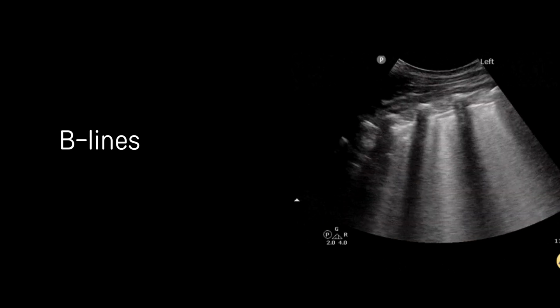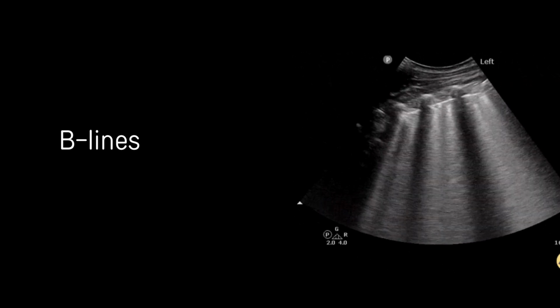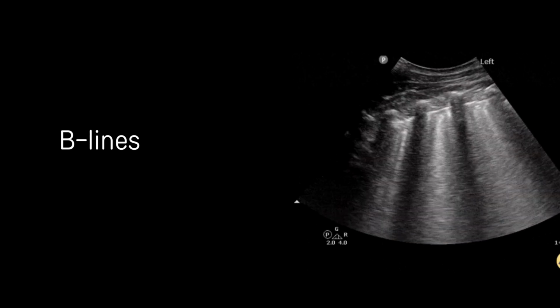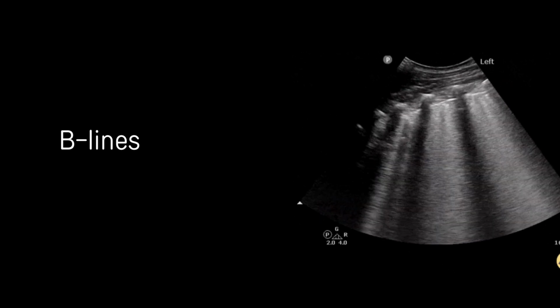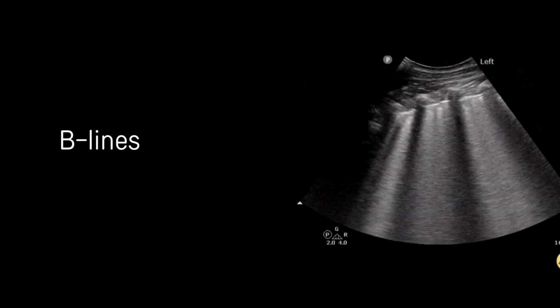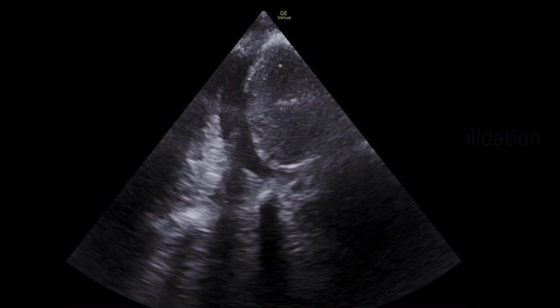There's something called the BLUE protocol. I don't want to go into the BLUE protocol. That helps you from a lung ultrasound point of view, figure out what's wrong with your patient. Why is your patient short of breath? It's on that POC app. POC 101.